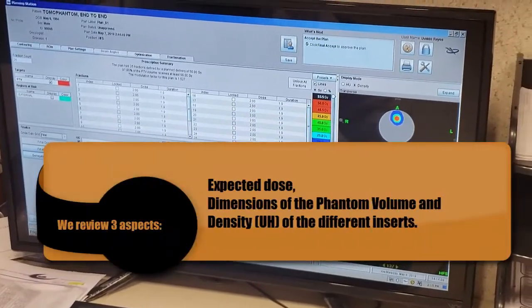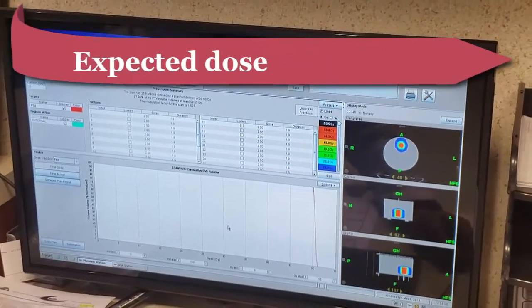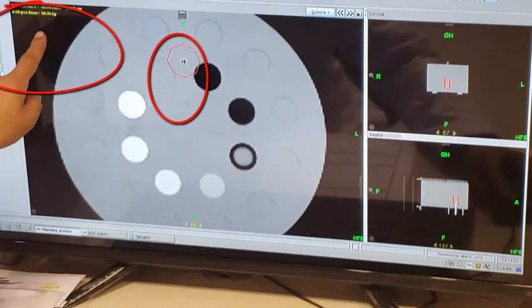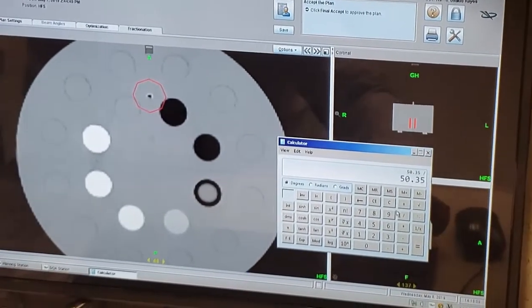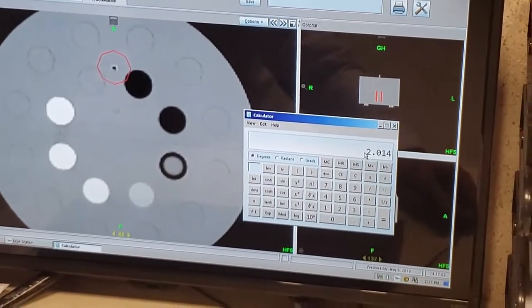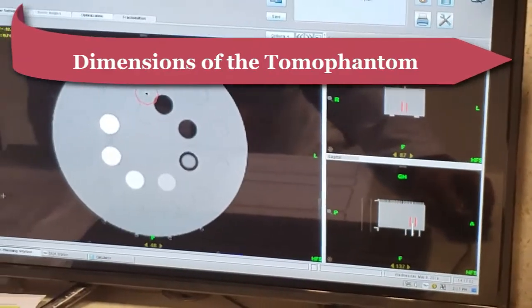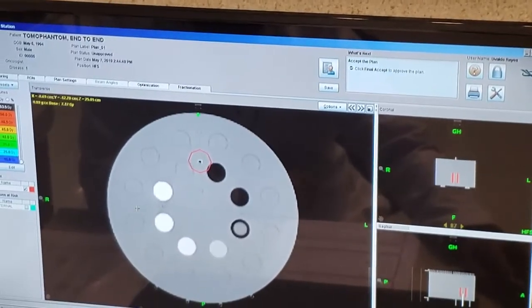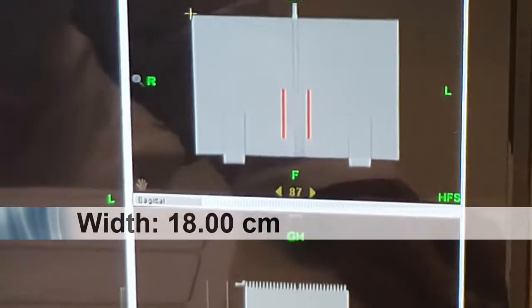To finish off our planning process, we'll analyze three things. The first is to check the dose the ionization chamber will receive — it indicates 50.35 grays in 25 sessions, so the dose we'll utilize is 2.014 grays per session. We'll also check the width dimension of our tomophantom using the terminal strip — the diameter indicates 30.06 centimeters and 18 centimeters width-wise.